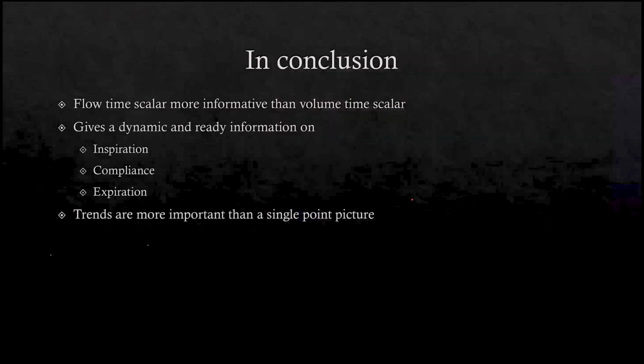So in conclusion, between the flow time and the volume time scalar, the flow time scalar is probably more informative and picks up problems in more clinical scenarios. But there are one or two places, as I already told you, where the volume time scalar does have a role to play. In combination, the flow time and volume time scalars help us a lot.